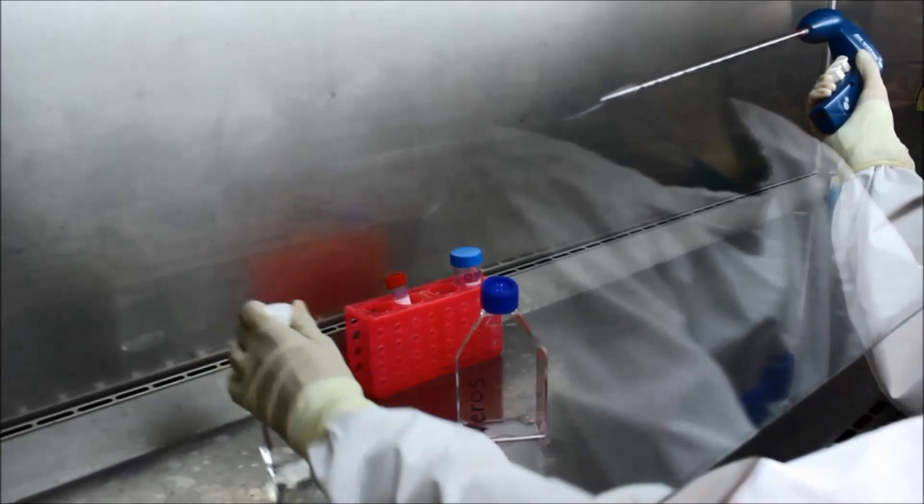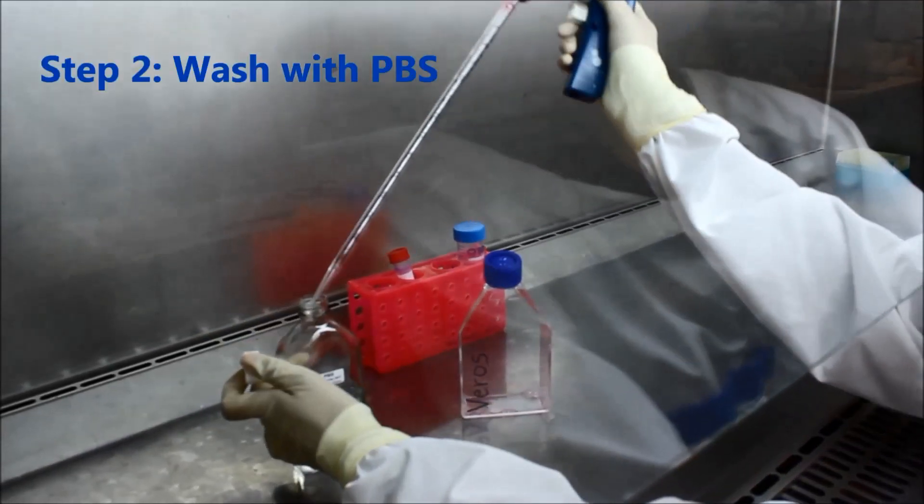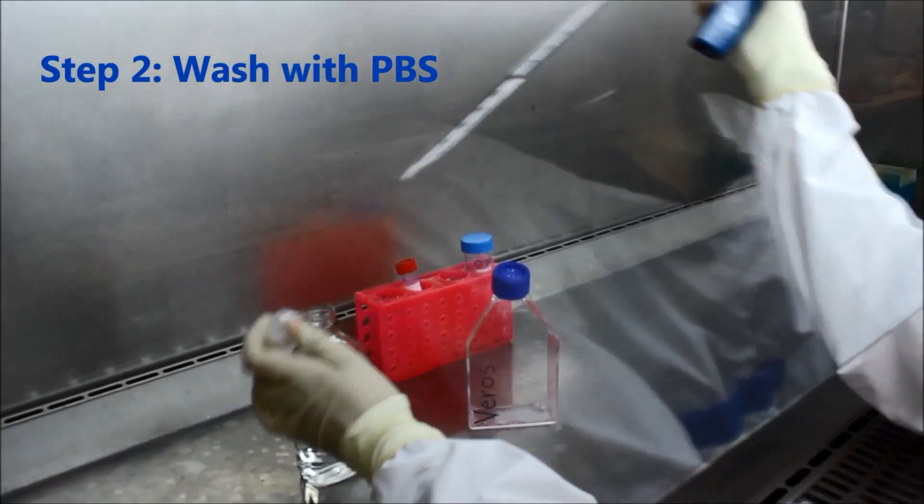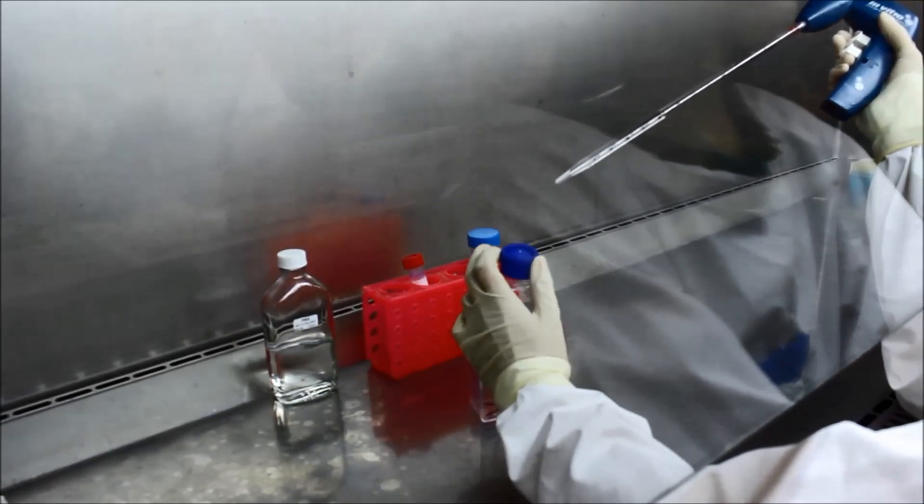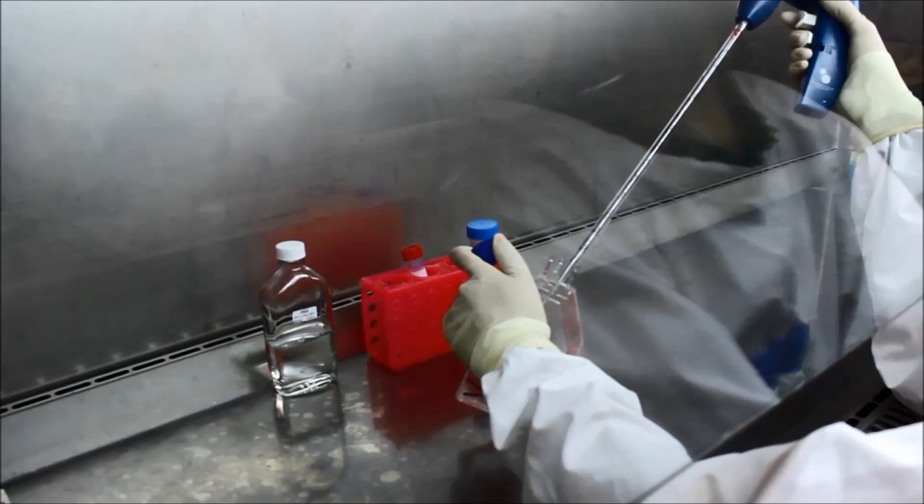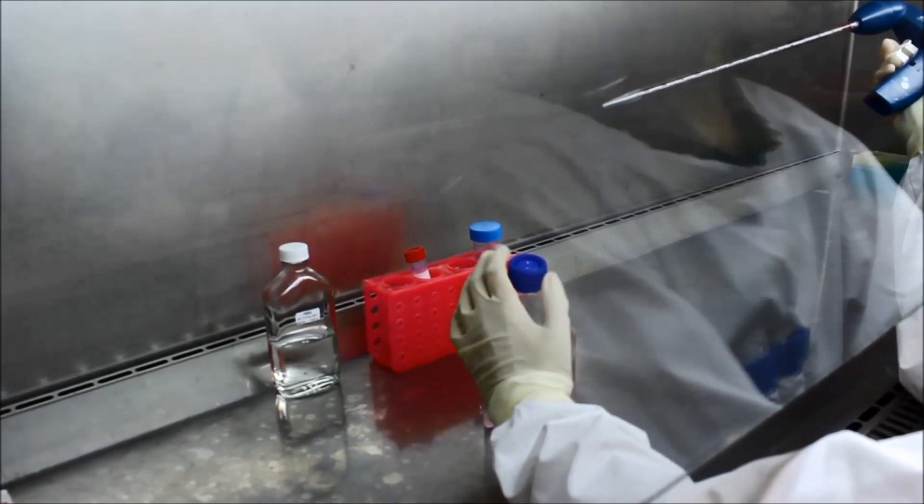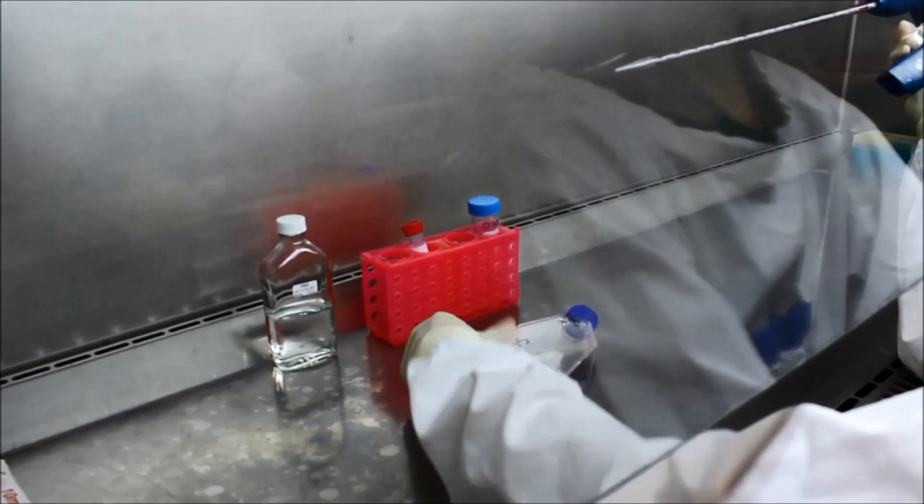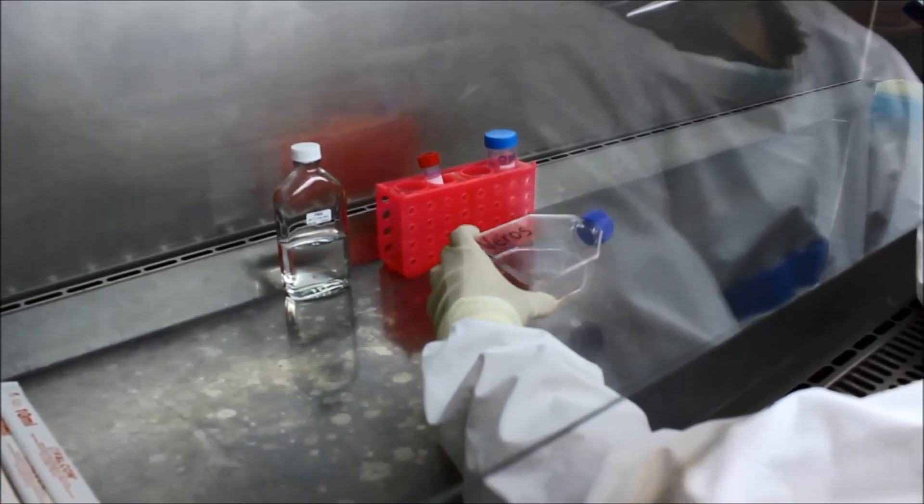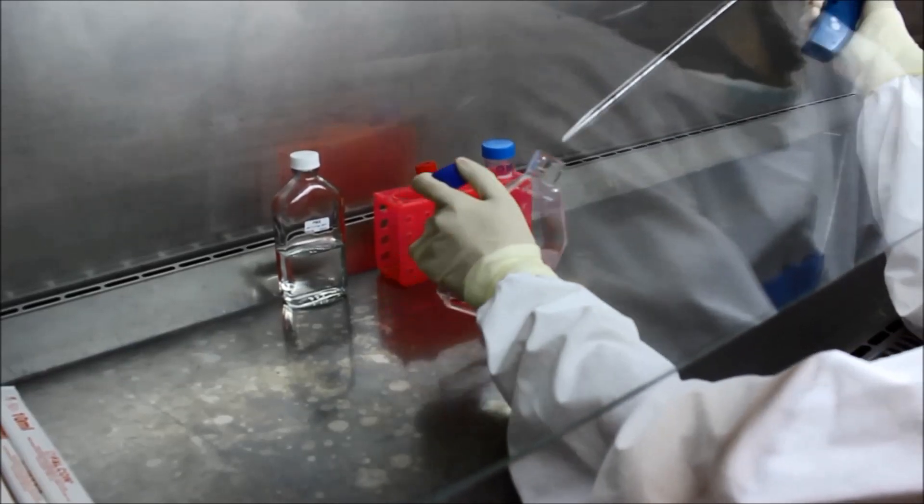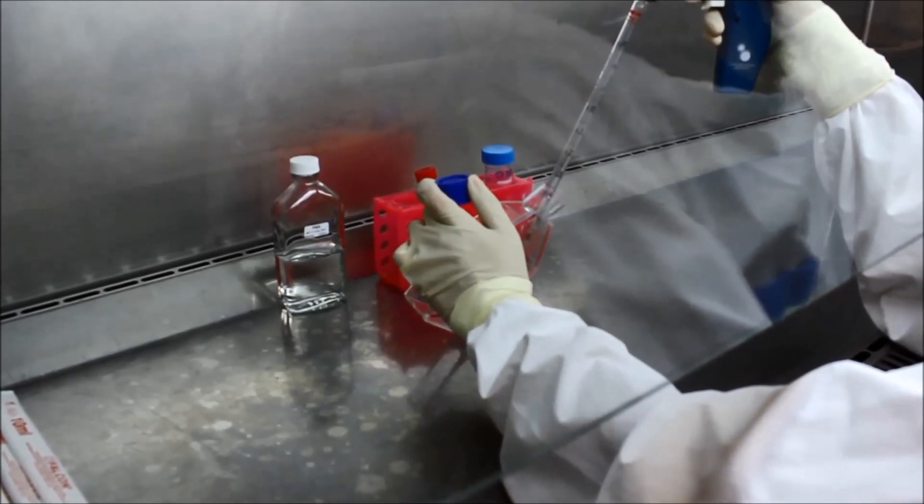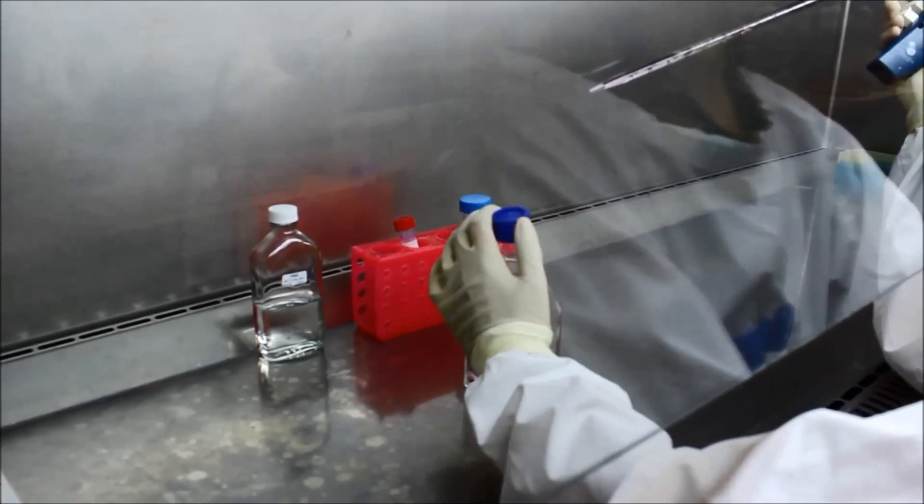Wash the cells by adding five mils of PBS to the flask and swirling on the base gently. Then remove the PBS and discard.